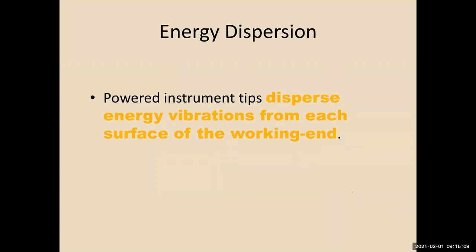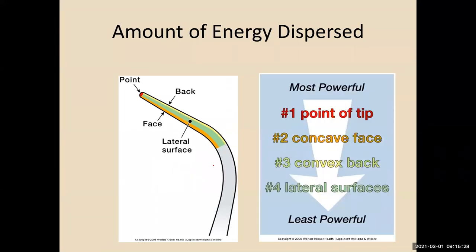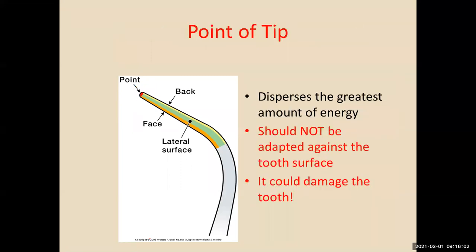Powered instrument tips disperse energy vibrations from each surface of the working end. So you have your face, your back, your point, and your lateral surfaces, just as you would with your manual instruments. The most powerful is the point of the tip. You're not using the point of the tip on the tooth surface. The lateral surfaces, look how high this is too, is the least powerful, but you do have power going all the way around 360 with your magnetostrictive. But most of the power is right there, 2 to 4 millimeters.